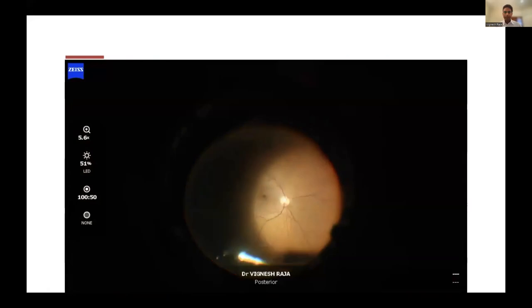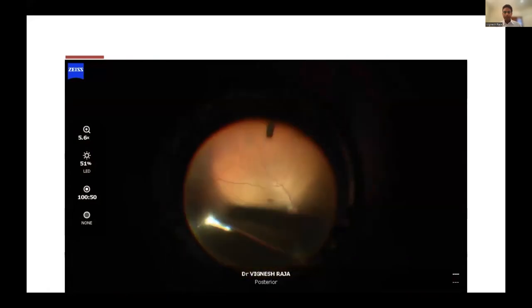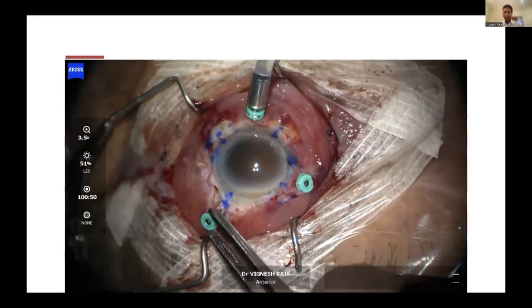So I've inserted the vitrectomy trocar cannulas, and I'm just doing a thorough core and peripheral vitrectomy.